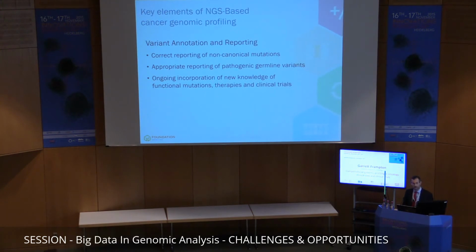And then, as I said, this field is changing rapidly, so a test and a testing platform needs to be able to rapidly incorporate new knowledge, both in terms of driver mutations or connections to therapy or clinical trials or other knowledge. So a test needs to evolve as the field is evolving.